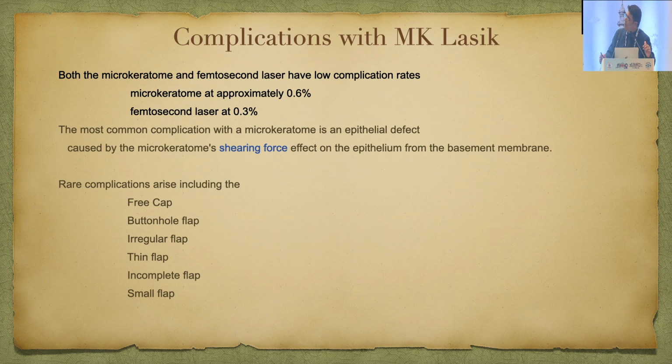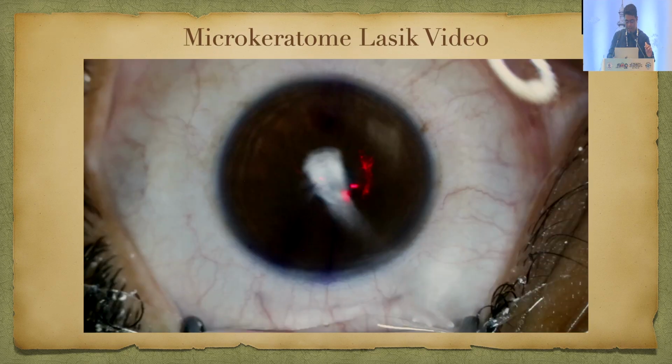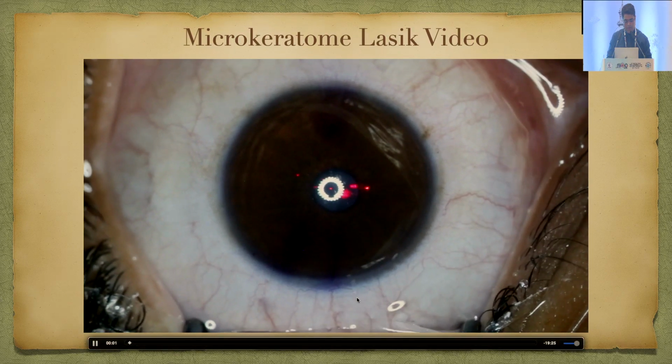So there are some complications, of course, which can happen with microkeratome LASIK, but if you look at the statistics, it's only 0.6%, with femtosecond it's 0.3%. The most common complication is the epithelial defect, which is caused by the shearing force. And there are other complications like free cap and buttonhole, which Dr. Rajesh mentioned. So I'll quickly show a short video of this.